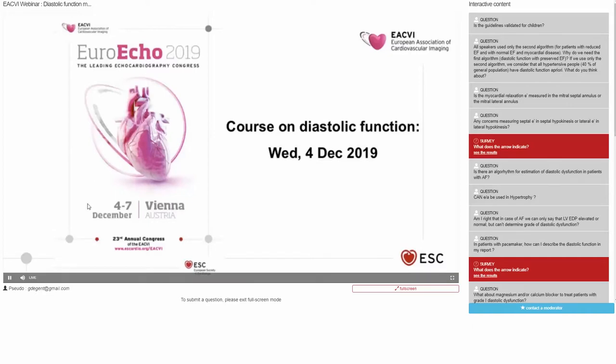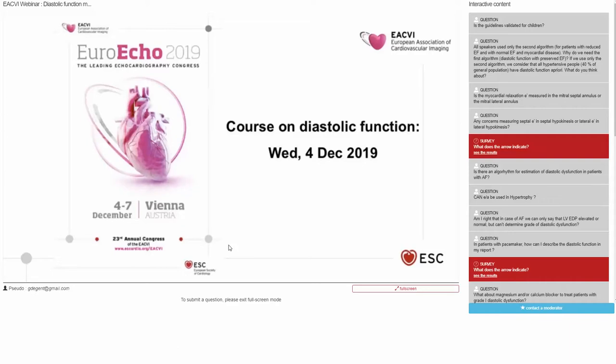For example, in atrial fibrillation, of course, left atrial volume is not reliable as a measure of diastolic dysfunction because it's increased due to atrial fibrillation per se. Also, you don't have Doppler parameters, A wave or AR wave, because it does not exist in atrial fibrillation, no atrial pump. So this is a bit more difficult than in other situations. However, we can apply similar sort of reasoning. For example, E prime is still very important, and Professor O has mentioned this is crucial because a reduced E prime is a measure of impaired myocardial relaxation. And then, yeah, we do not grade diastolic dysfunction in atrial fibrillation.